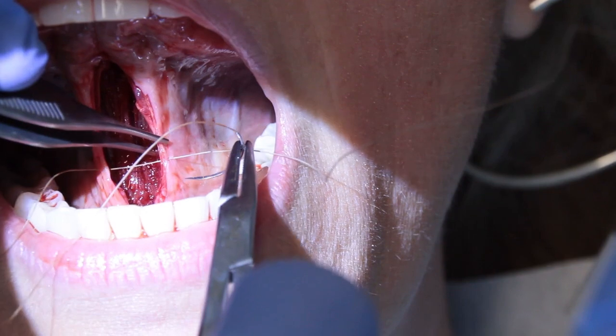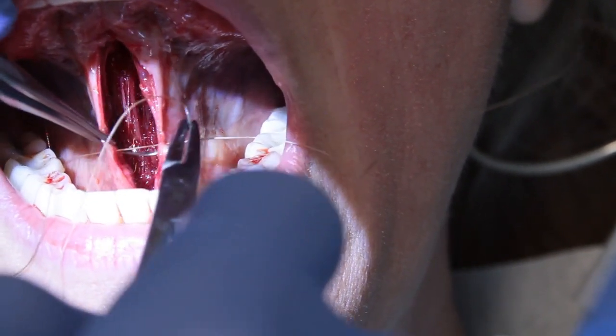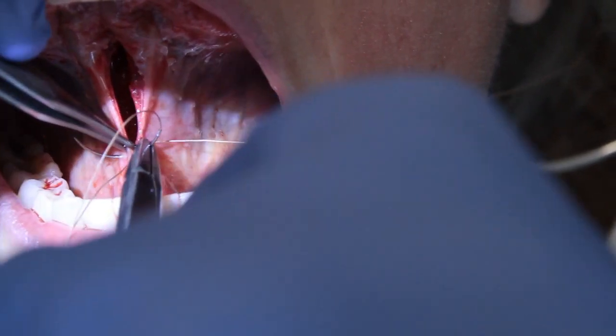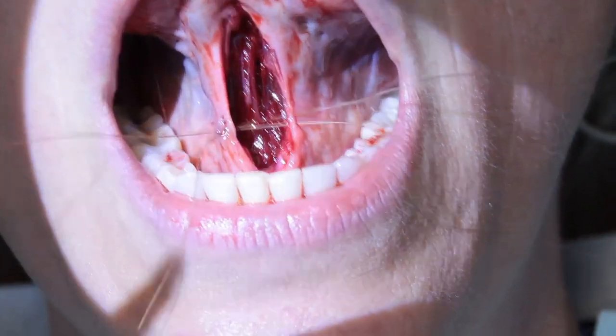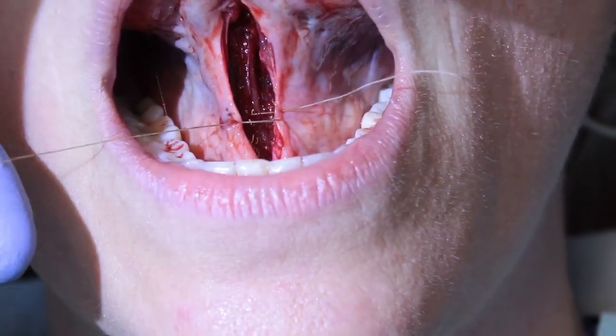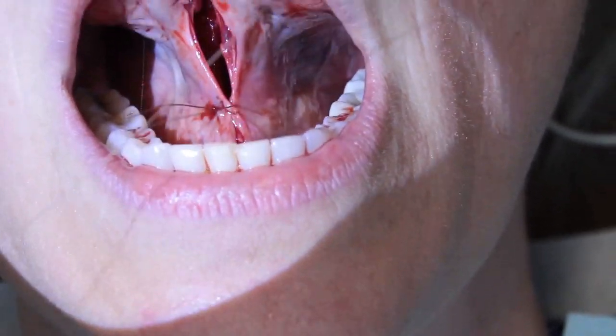So I go twice in the same way. You guys seeing this? Twice in. This is really going to give it added strength, because I want that to be the base of the closure. So right there — see how nice and strong that is? Relieve the tension off the wound.